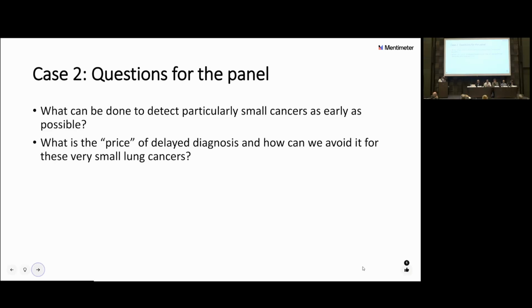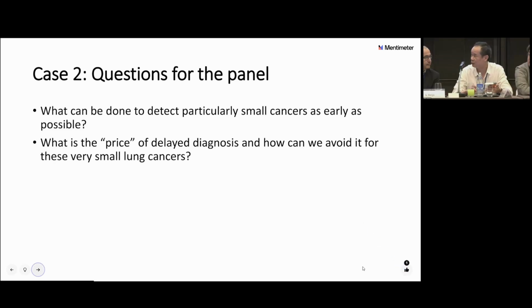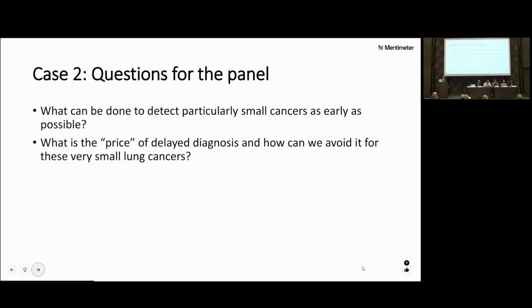Okay, any other comments from the panel? Matt? So I've noticed that at my institution, if the nodules are only 1 millimeter, we don't call it, we just ignore it. And if it's 2, then we'll start describing it or measuring it and reporting it. So for 1 millimeter, we figured they're going to come back in a year. We're going to see it again if it's bigger, but we don't even put it in a report if it's 1 millimeter.